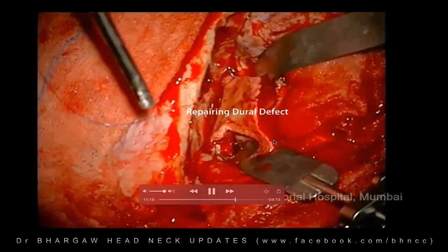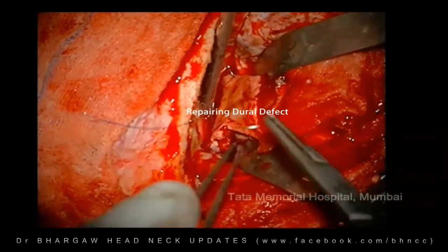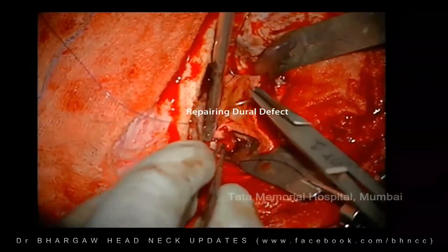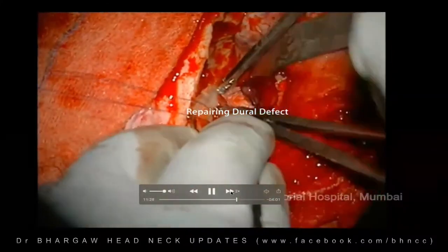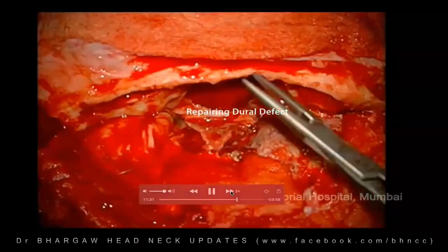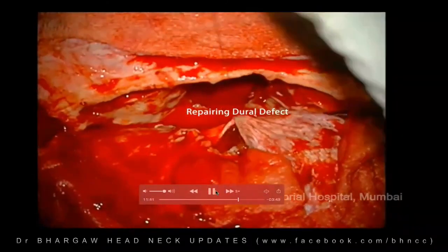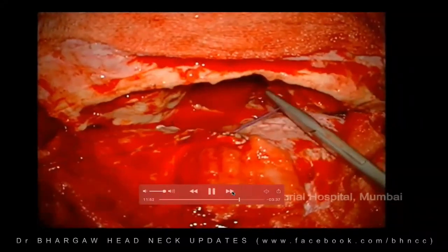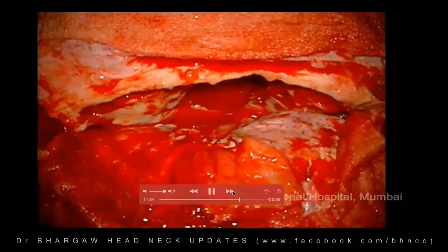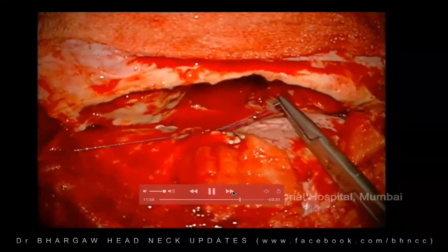That is being repaired all around. So that seal is being achieved to begin with, and then the second layer will be formed by the pericranial flap.